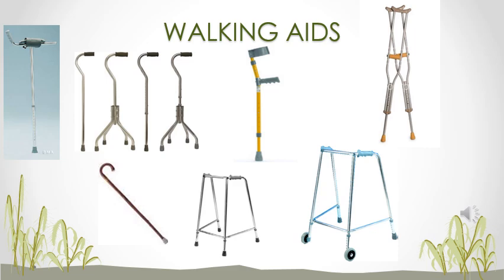So you can imagine that for somebody that hasn't got the strength and often the balance to lift up the walking frame and put it forward, the walking frame with the wheels on will make it easier for them to walk.